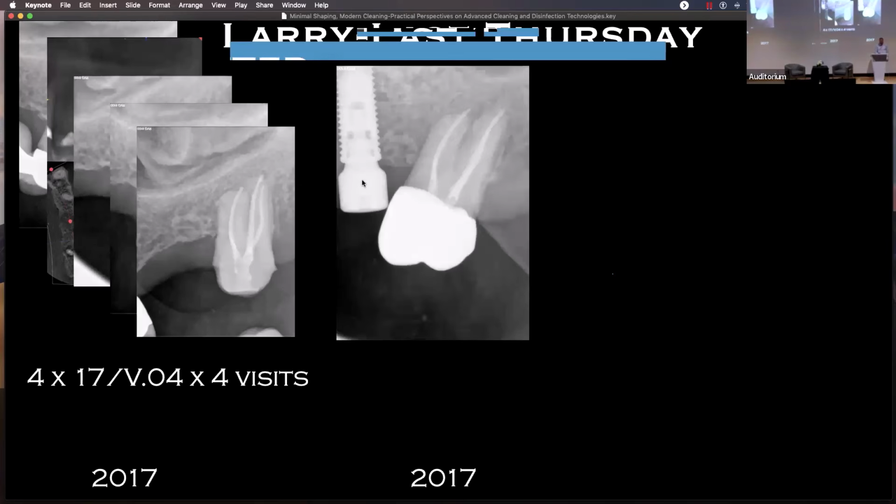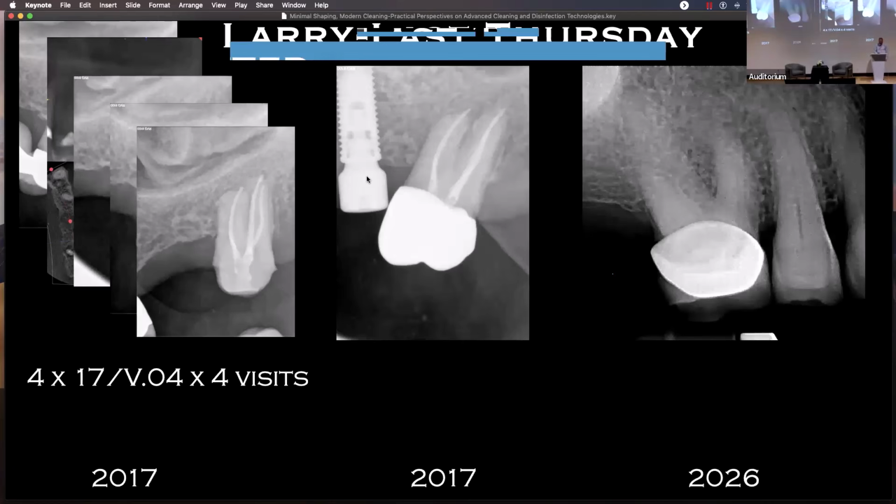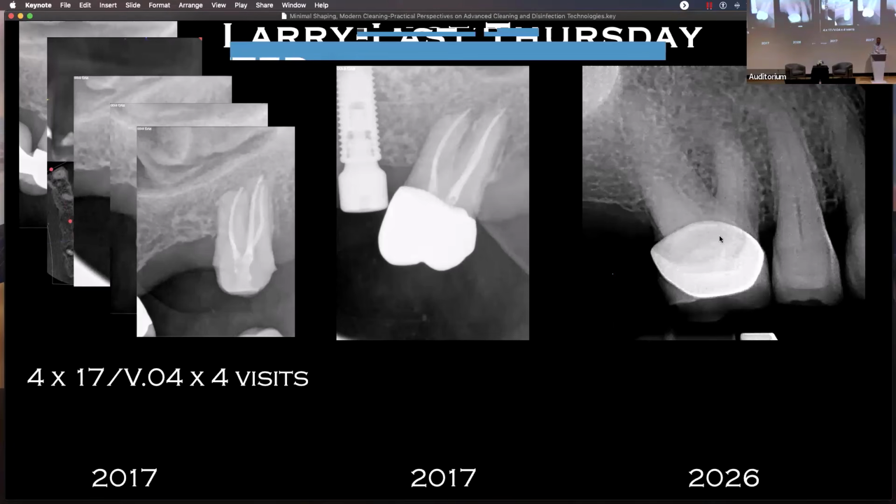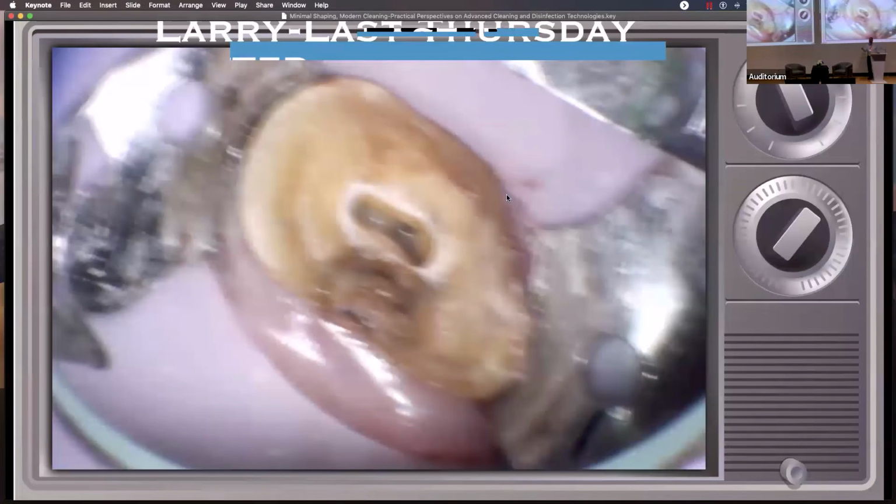There's the follow-up. Someone put an implant in there. I got him back and got a later follow-up, which you'll see. We saw him for this tooth in 2026. This necrotic maxillary molar. But I want to show you, we've been doing these small accesses and small shapes because some of the evidence, 3 pieces of evidence, is cases from private practice. So these aren't cherry-picked cases. These are just cases from last Thursday.